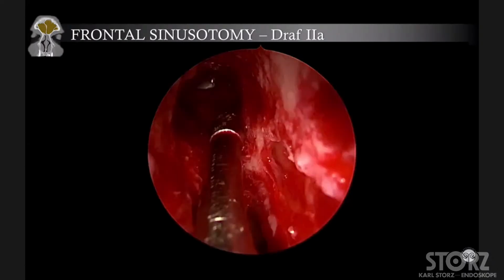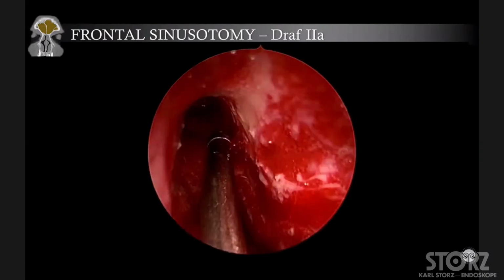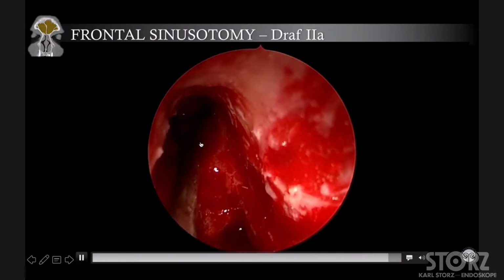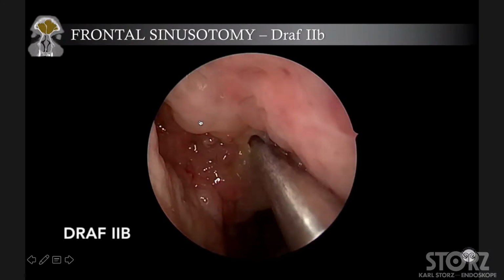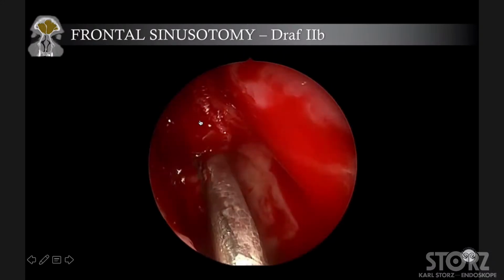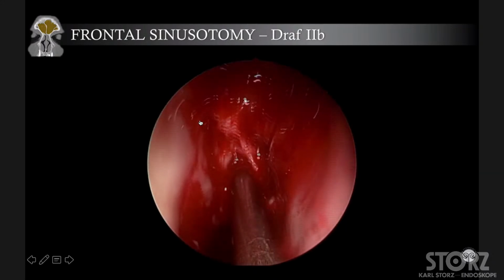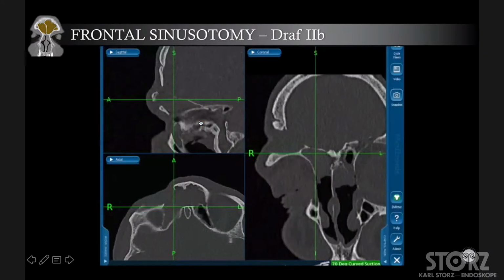And we can completely open here, completely open the frontal sinus, and the posterior wall of the frontal sinus is visible. Finally, Draf type 2B. In Draf type 2B, we have to cut completely the middle turbinate, and the floor of the frontal sinus will be opened until the nasal septum.